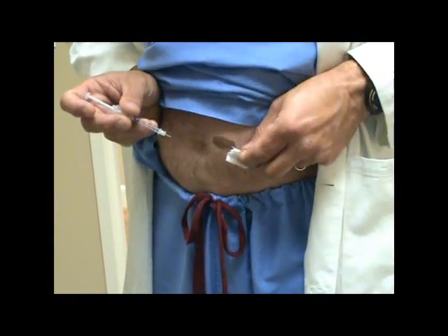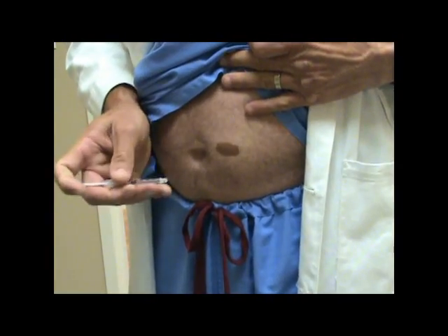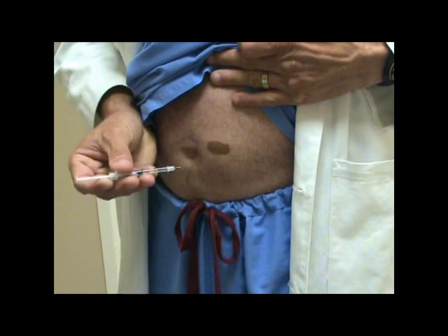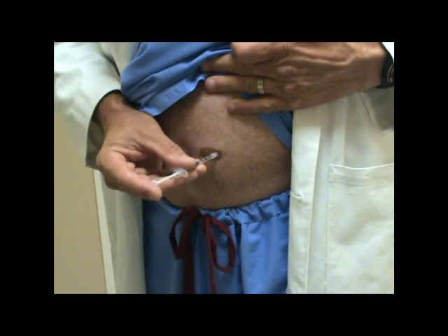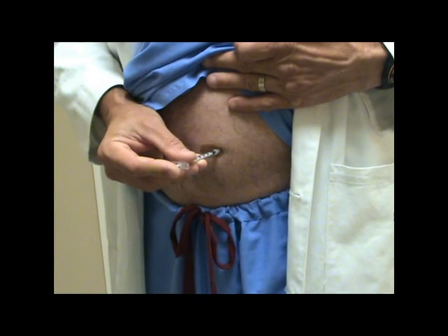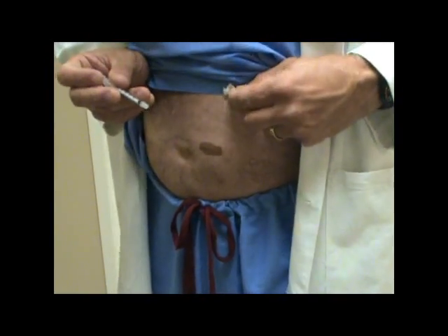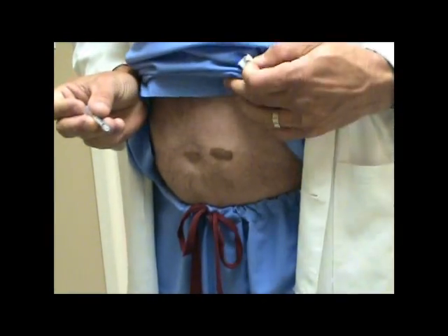To do the injection, wipe the area with an alcohol sponge — or it could be soap and water. Take the needle; it's a very small needle. Go directly into the skin, maybe at a little angle, and push directly. You do not need to aspirate, because it's just in the fat. Pull it immediately out. If it's bleeding, you can wipe it — most of the time it is not.